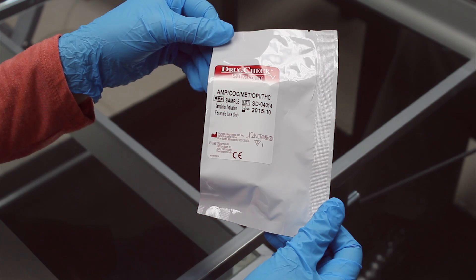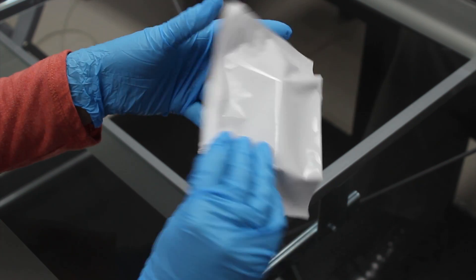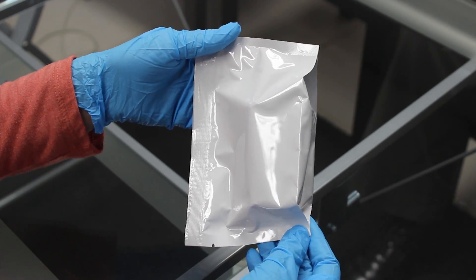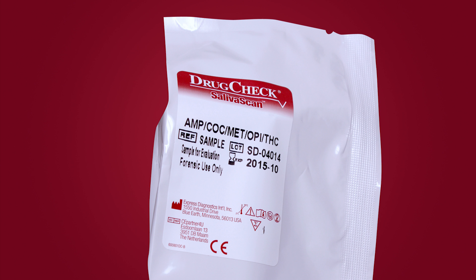Visually inspect the foil pouch containing the test device to ensure that the pouch is intact. Do not use if the foil pouch is not intact, with seal broken, tears, holes, etc. Verify that the expiration date printed on the pouch is valid. Do not use if expired.